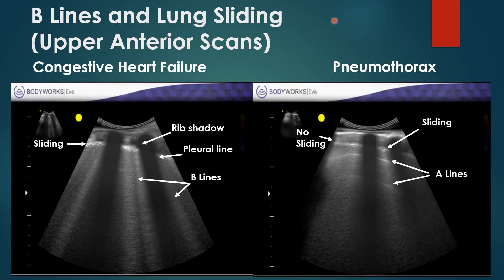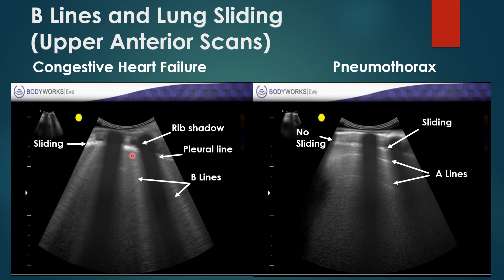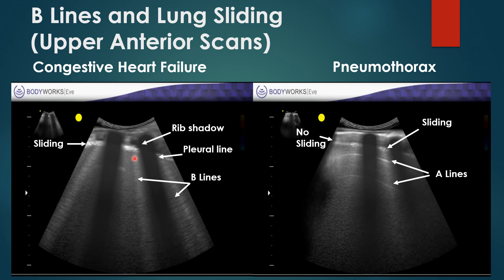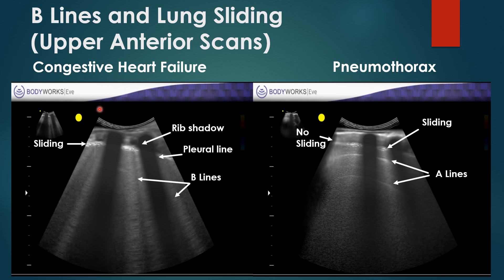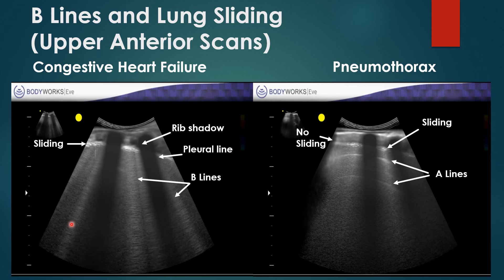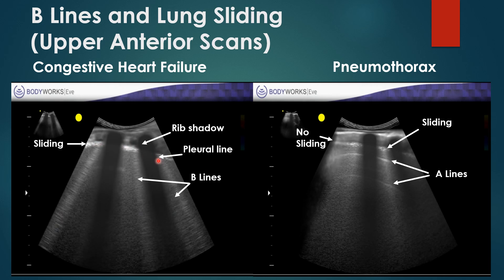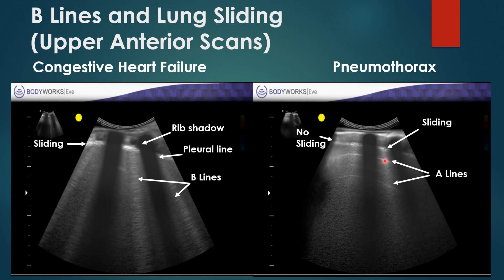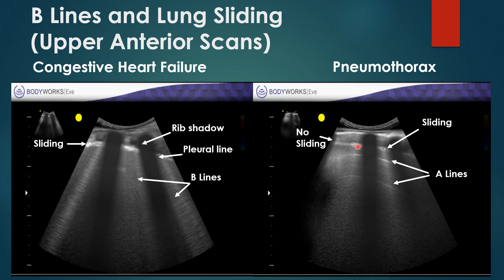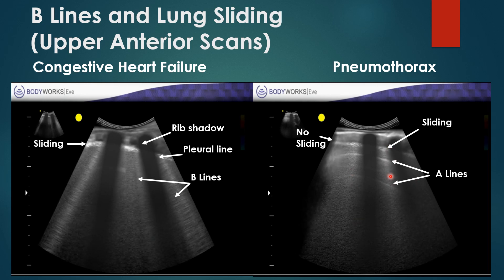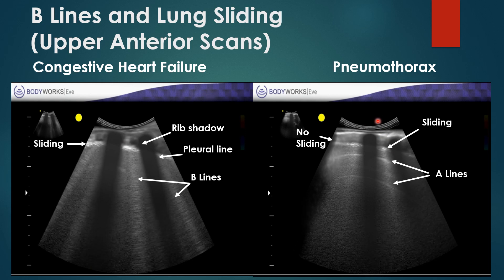B-lines are basically alveoli filled with fluid or some type of interstitial disease. In a patient with congestive heart failure, you can see a lot of B-lines representing fluid-filled alveoli, with a pleural line showing some sliding and a rib shadow. In contrast, with pneumothorax, you can see sliding around the lung point on one side but no sliding on the other, indicating the lung isn't really moving. You do see some A-lines from normal reverberation from the transducer on the chest wall.